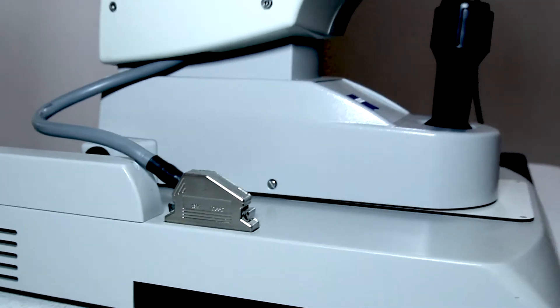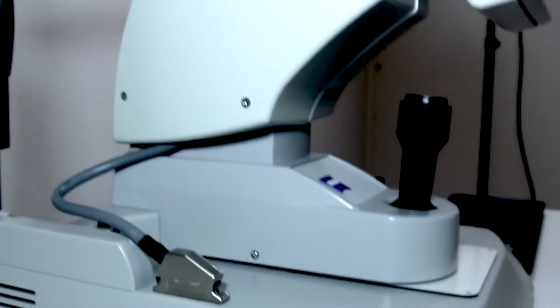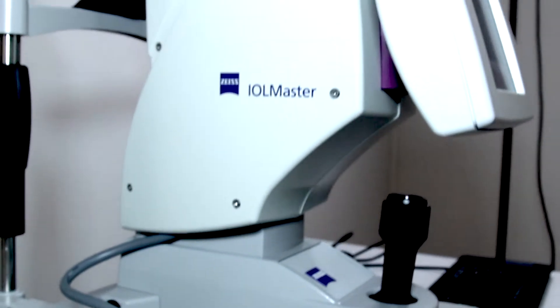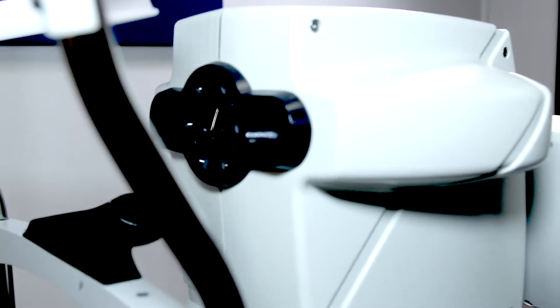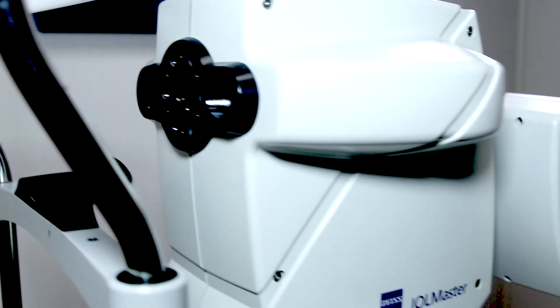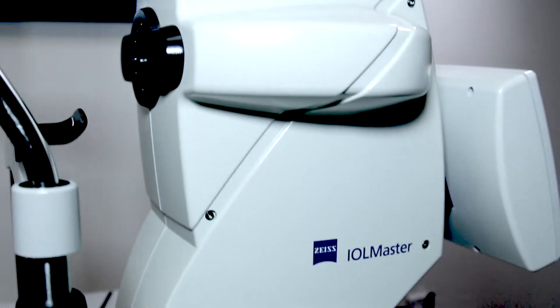The IOL Master is more efficient because it allows measurements to be taken with complete confidence in the accuracy of the results.